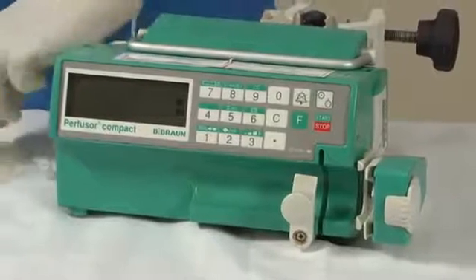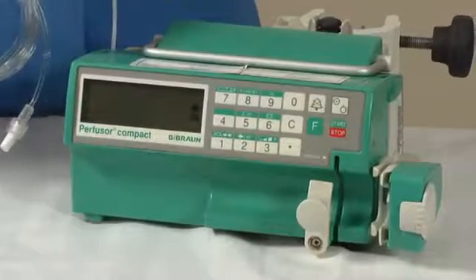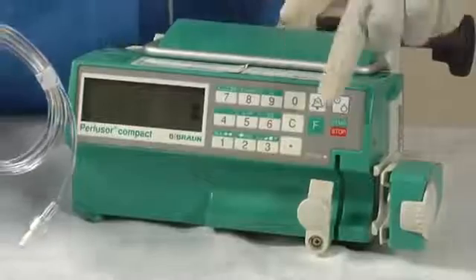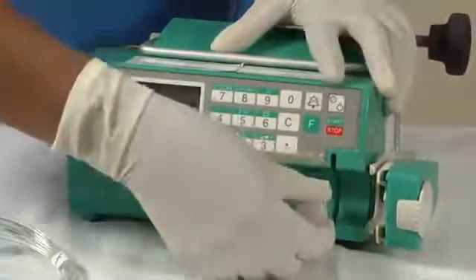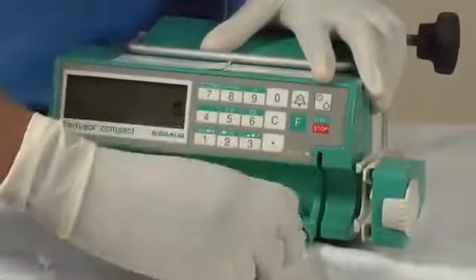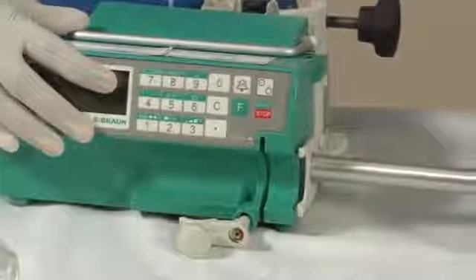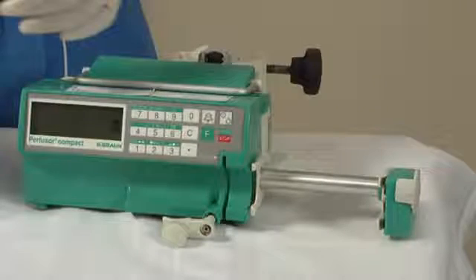Now take the previously prepared syringe which is filled with the drug solution. Before we insert the syringe into the pump, the two locks should be released. The front lock should be turned by a quarter circle to the left side, and the side lock should be lifted and the arm pulled out so that we can put the syringe into the pump. After opening both the locks, the pump will look like this.